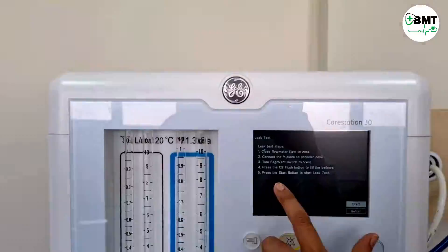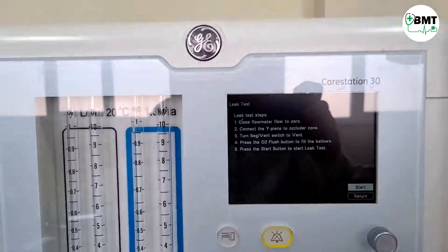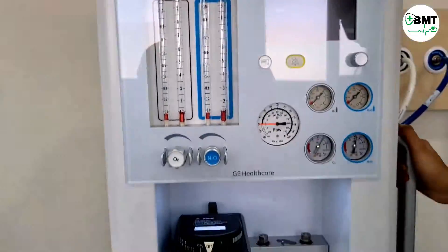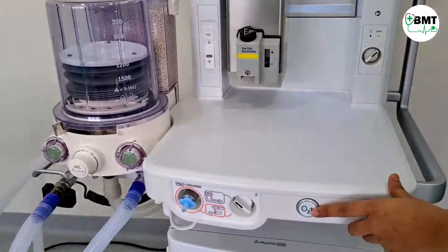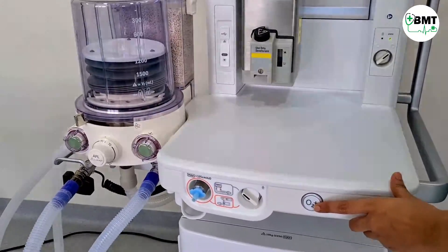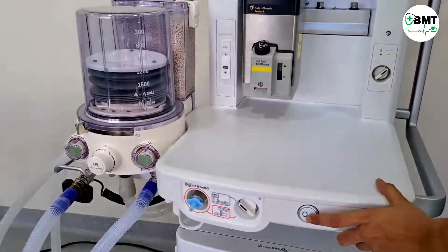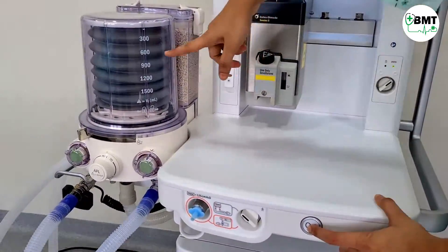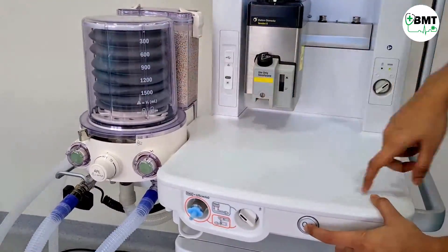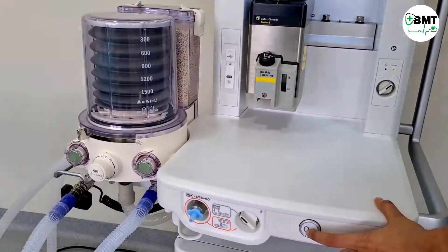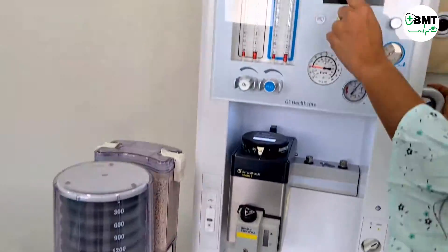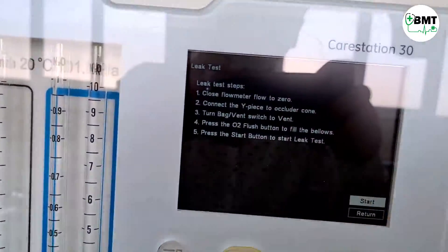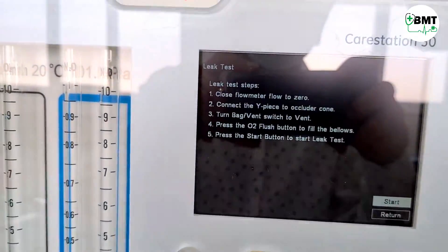Now press the O2 flush button to fill the bellows. This is the O2 flush button. Press it and the bellows will get filled.